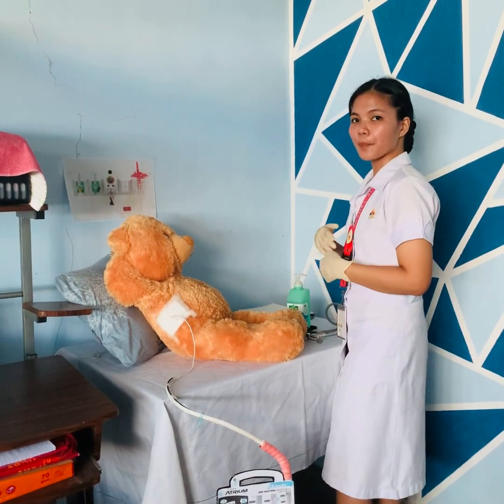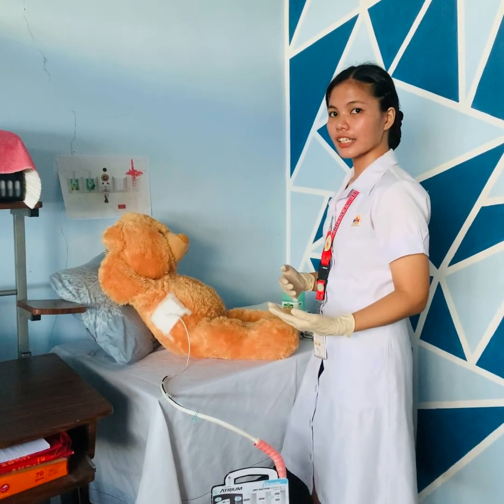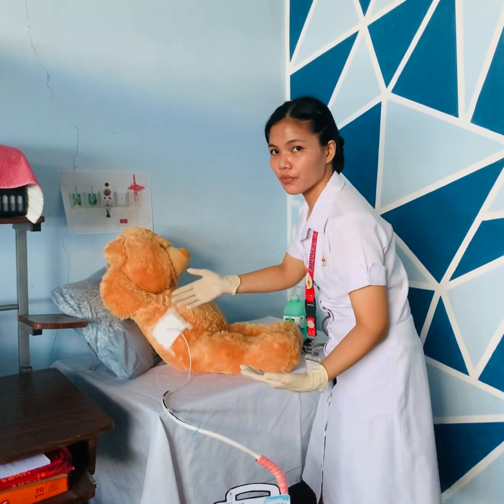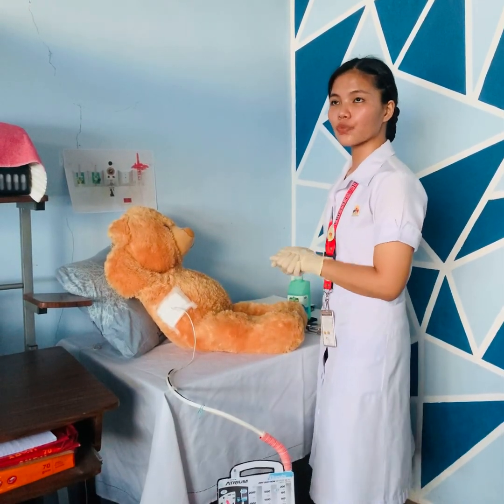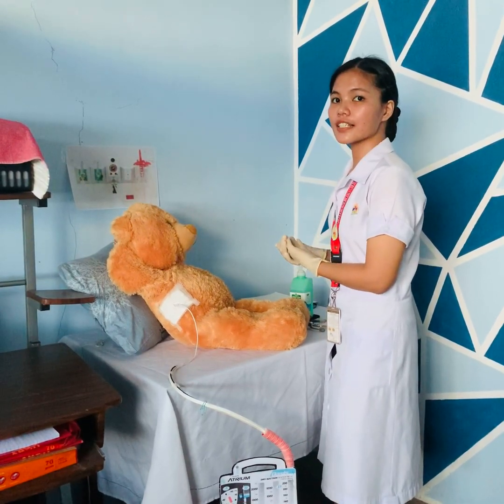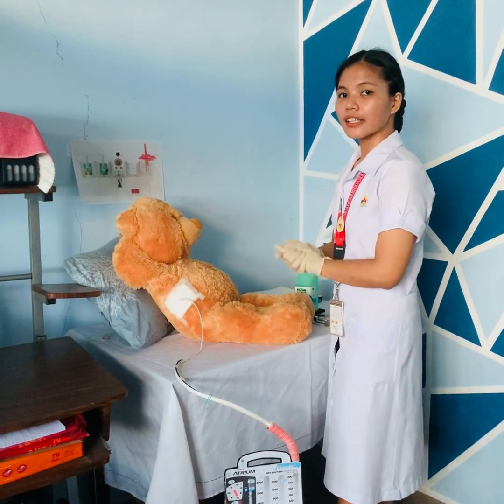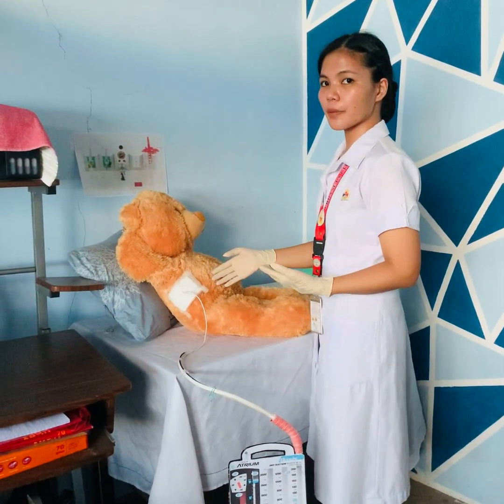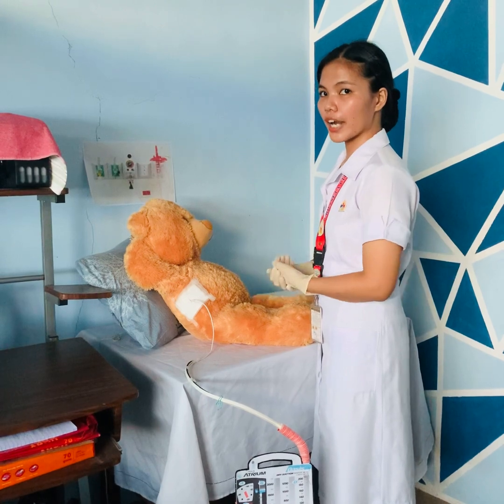Assess the chest tube insertion site to ensure that the sterile dressing is dry and intact, and no drainage holes should be visible on the chest tube. Dressing is generally changed 24 hours post-insertion, then every 48 hours. The chest tube is generally sutured in place. Also check the insertion site for signs of subcutaneous emphysema. There should be no fluid leaking around the site or sounds of air leaks.